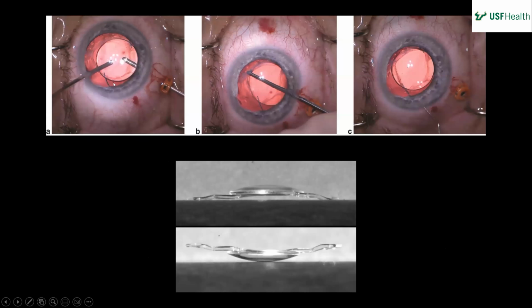In the top, the surgeon placed it in the sulcus, and now they're slowly putting the lens optic into the bag, but the haptics remain in the sulcus. That's called optic capture. It helps reduce the risk of developing this complication. And upside down syndrome is when your IOL is facing posteriorly when it's in the AC. So you can imagine that could also cause more chafing.